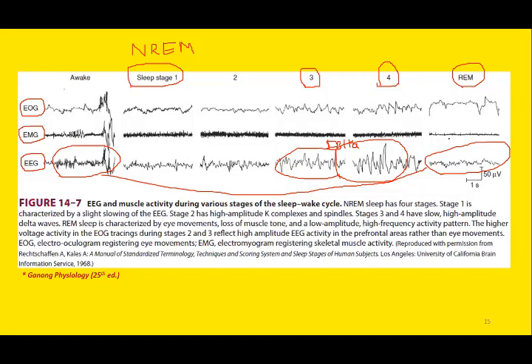So this is beta wave. Beta is observed in REM sleep as well as in an alert awake person. Stage 3 and 4 of non-REM are characterized by delta waves. As far as stage 2 of non-REM is concerned, this unique EEG pattern is known as the K complexes or sleep spindles. We will discuss what K complexes and sleep spindles are at the end of the discussion, inshallah.